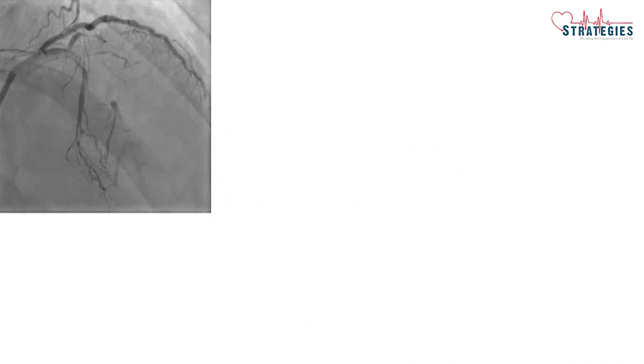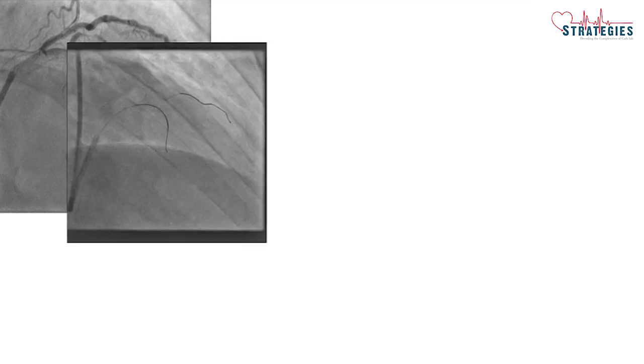So this is the epicardial view showing a good septal to septal collateral, and this is a 7 French guide into the left system from femoral with a long sheath, and one wire is into the diagonal just to give support to the catheter, and with another wire and Caravel.